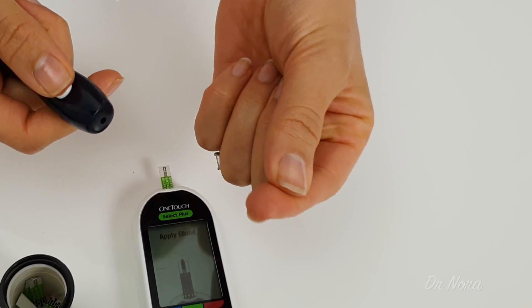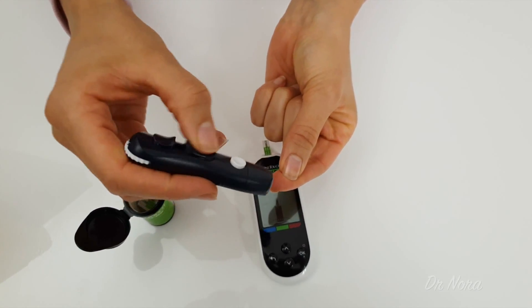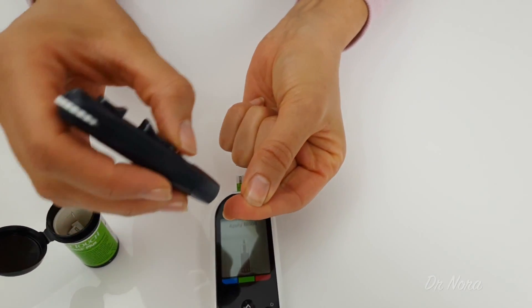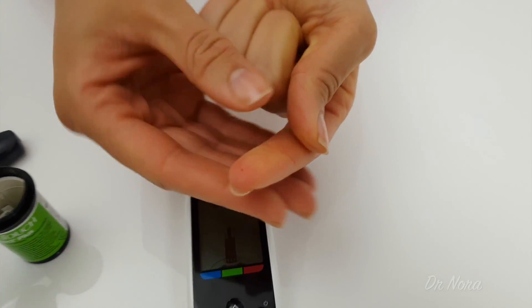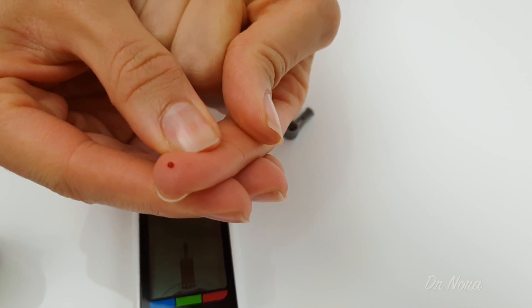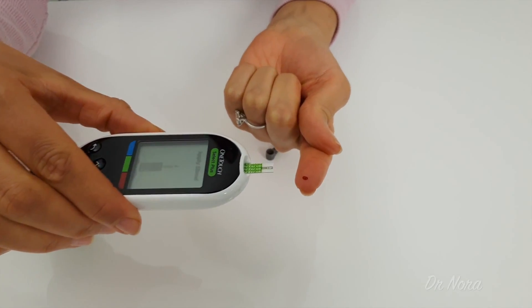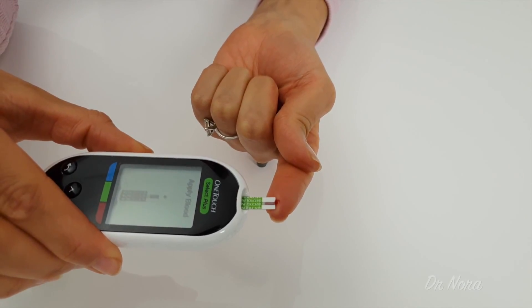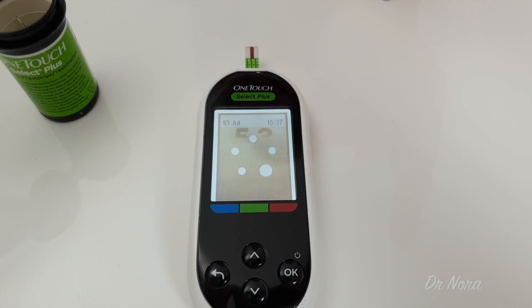First up, you want to squeeze your finger, get a nice pulp of your finger, get your lancet device, load it up and press on the button. Now squeeze some blood out of your finger so you get a nice droplet of blood. Once you've got that, place your blood next to the testing strip. And there you have it — you can use a cotton bud just to wipe away any of the excess blood. And voila, you've got your blood sugar level.